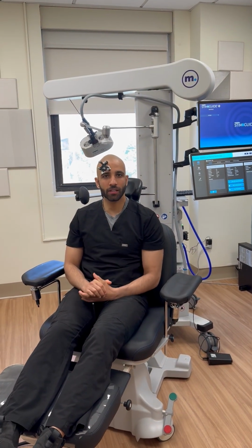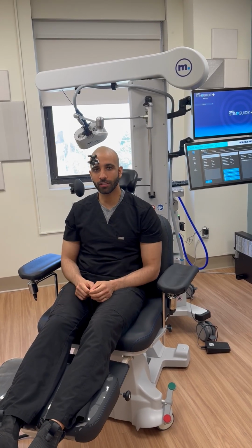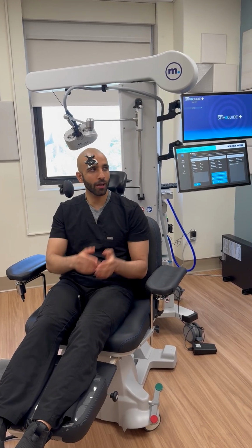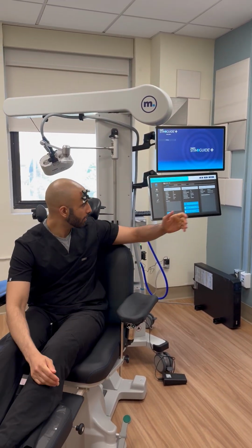This is going to be a small demonstration about how to set up everything for TMS and get you to the treatment, just before starting treatment. We have Dr. Cotto going to help us out, so much appreciated.